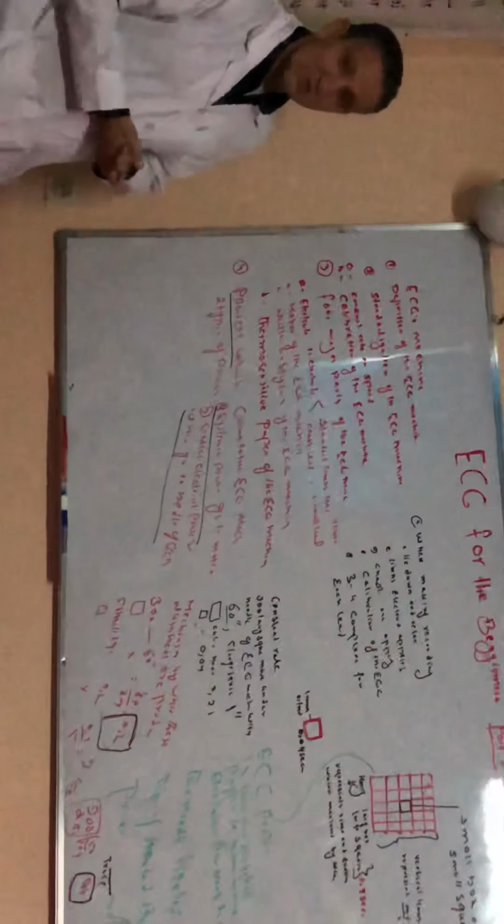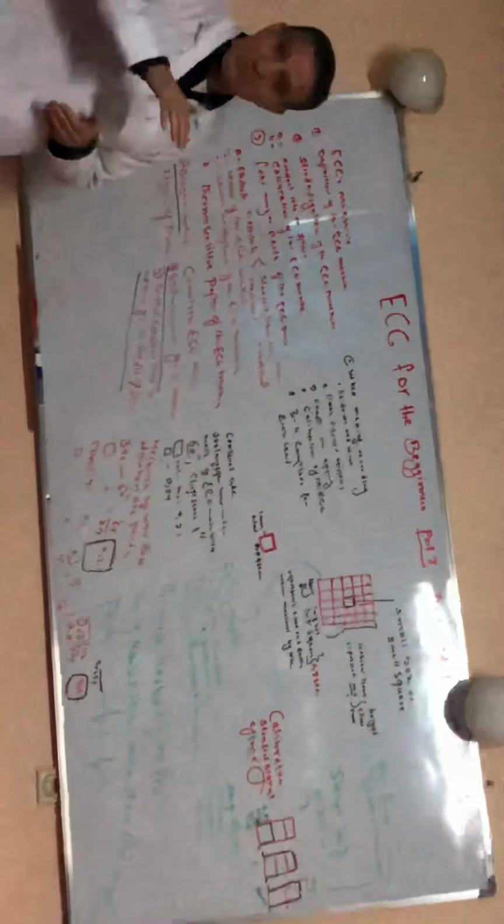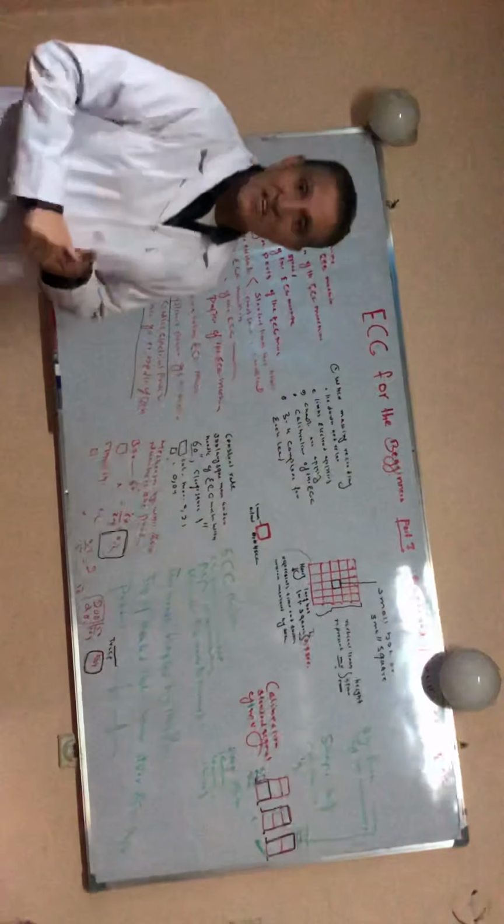The second part, the motor. This motor is also fitted in the ECG machine. And what does this motor do? Remember, there are 2 types of electricity that come to the ECG machine. One comes from systemic or general power. This general power goes through the motor, and the motor moves the paper, and the paper moves under the stylus of the ECG machine.